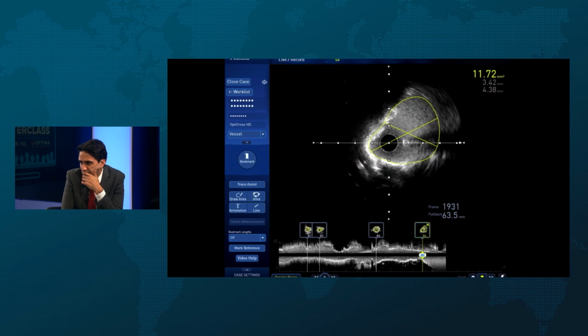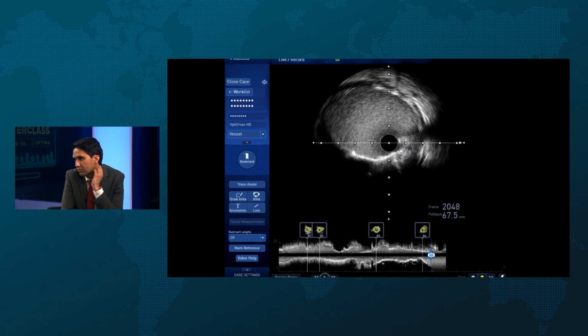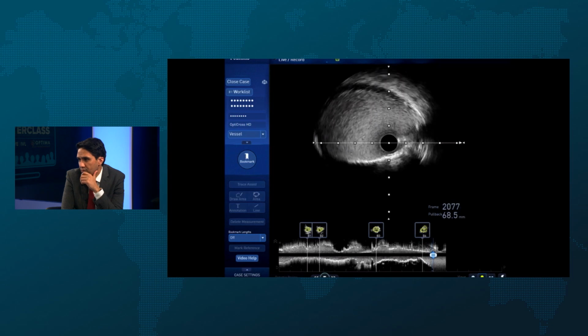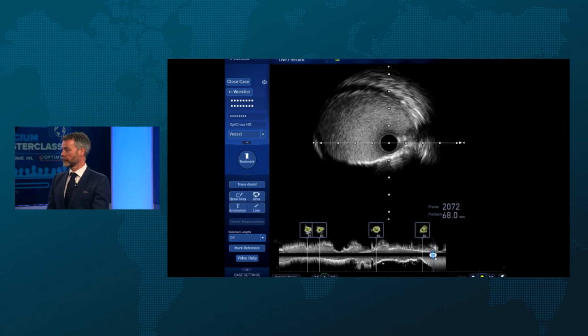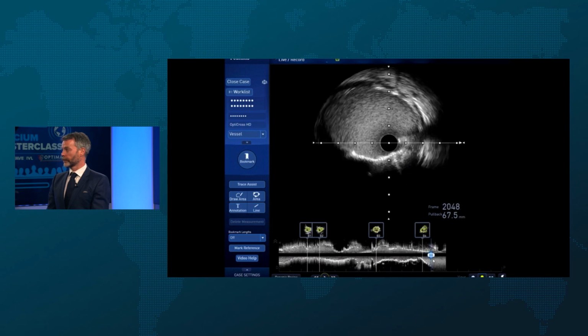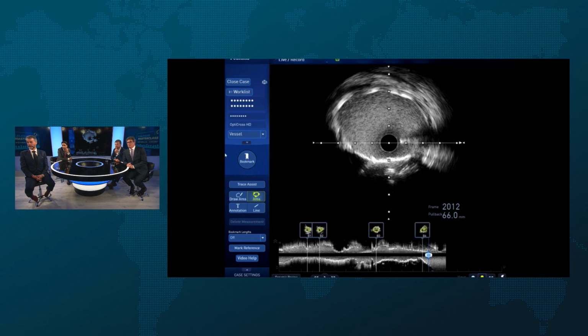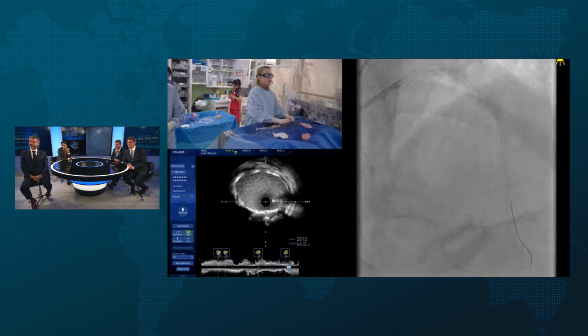For the ostium. So time for a final angiogram, because I think Claudia has been post-dilating whilst you've been walking us through this IVUS, Margaret. And the front end of the stent looks perfect. Transitions perfect, really nicely. Lovely. Great. Certainly we're getting the top tertile and excel here.